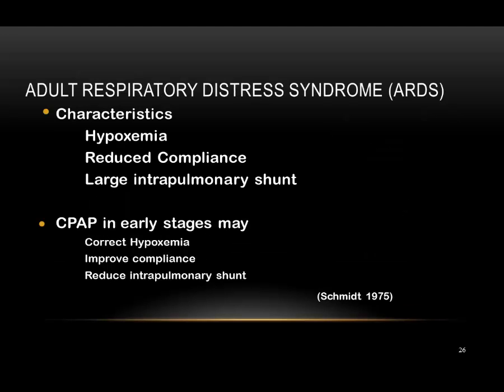Acute respiratory distress syndrome, or ARDS, is a common and devastating condition which can affect all adult patients. It occurs when non-cardiogenic pulmonary edema, secondary to acute damage to the alveoli, leads to an acute respiratory failure. In early ARDS, continuous positive airway pressure with 40 to 60% oxygen may be adequate to maintain oxygenation.